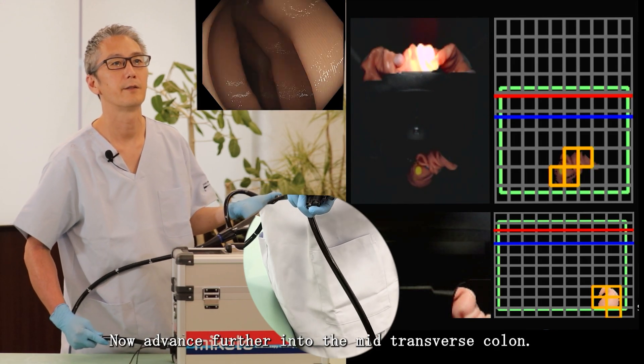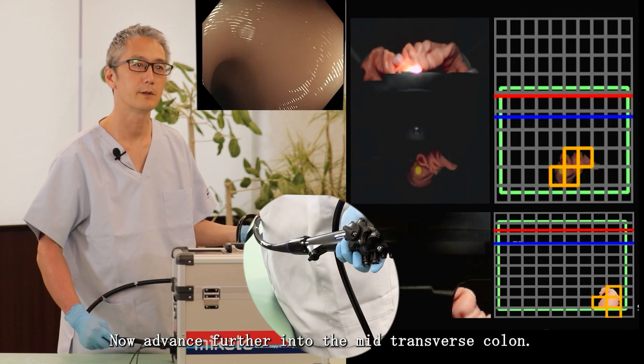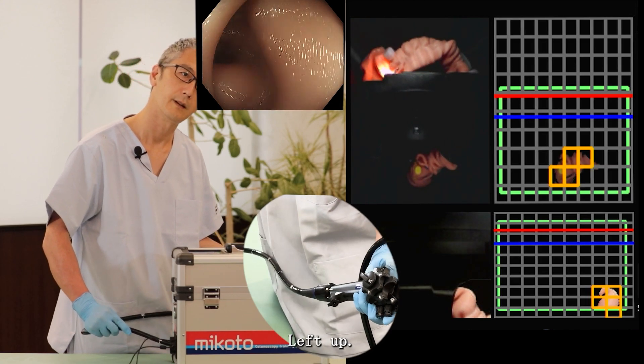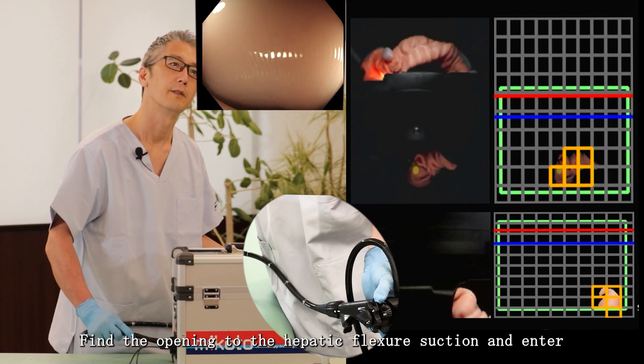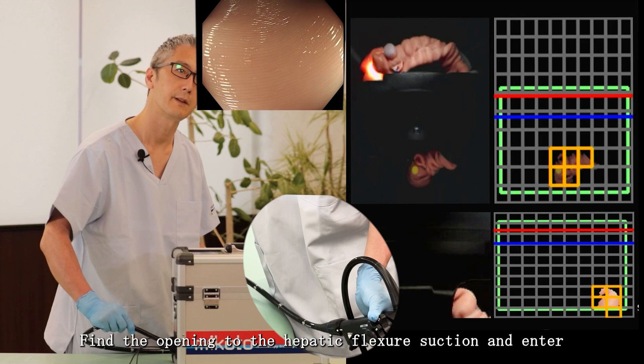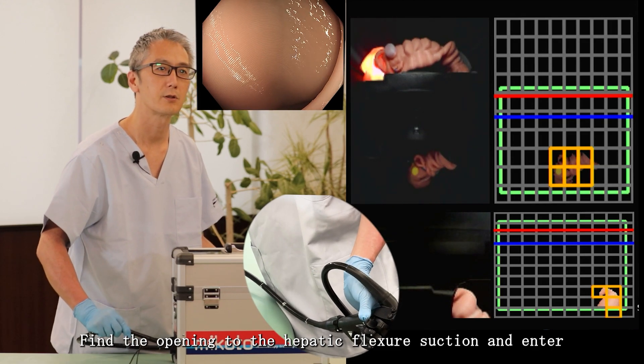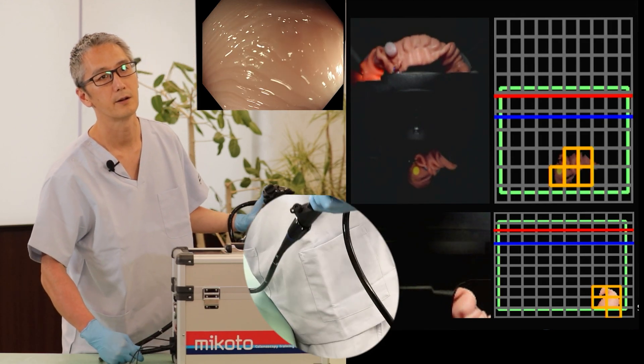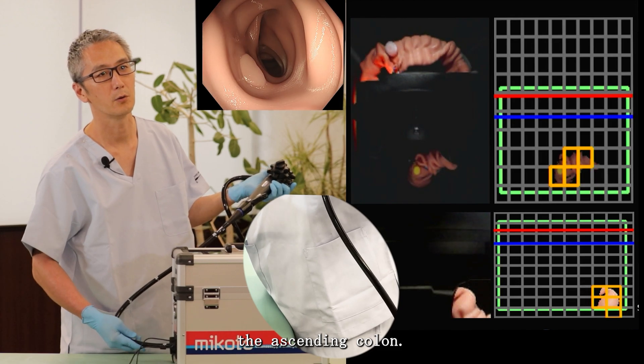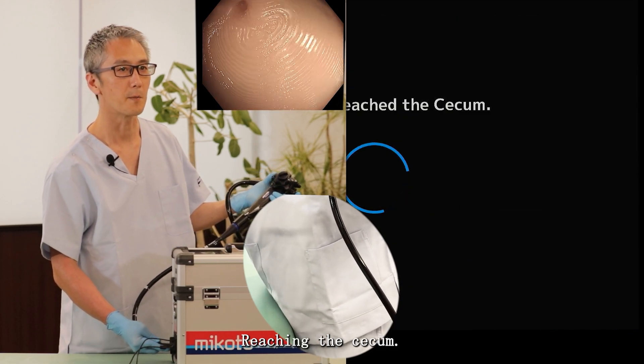Now advance further into the mid-transverse colon, left up. Find opening to the hepatic flexure, suction, and enter the ascending colon reaching the cecum.